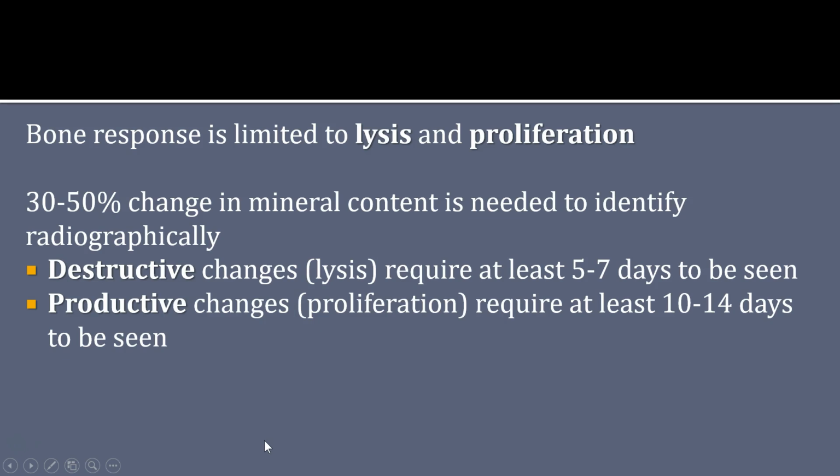Unfortunately, there are also many more disorders than types of responses. So different disorders can have similar radiographic appearances, and lesions typically distinguished by a constellation of findings may have an atypical appearance on radiographs.